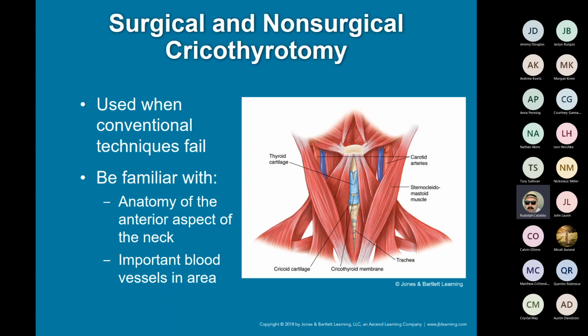We're going to jump right to crikes. All right, so surgical and non-surgical crikes. Surgical is using a scalpel or some sort of sharp-edged device to create an opening in our cricothyroid membrane, right here, that small little spot, to where we can ventilate the patient.